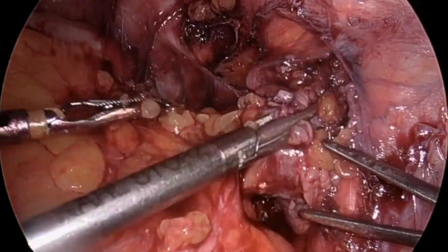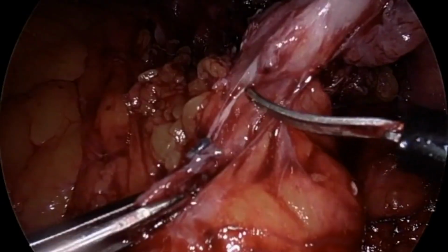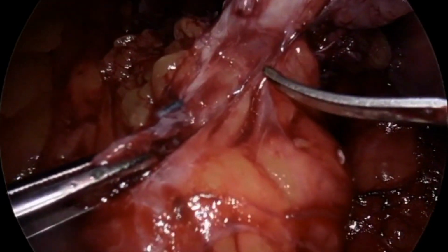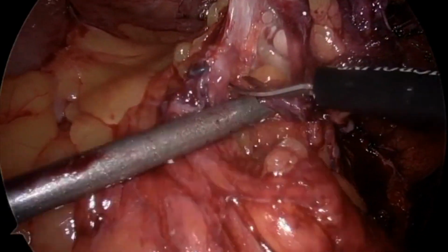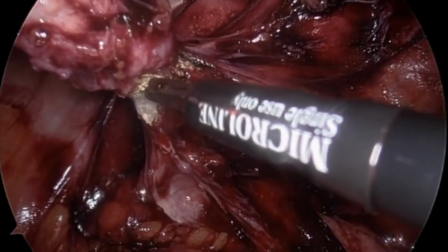We are now left with the ovary's inferior attachments close to the bowel. These were taken down with a combination of sharp and blunt dissection. Although we were confident that the bowel was far from the surgical field, in cases of uncertainty, a bowel probe can be used. With the bowel now far from the surgical field, we began to use electrosurgery.